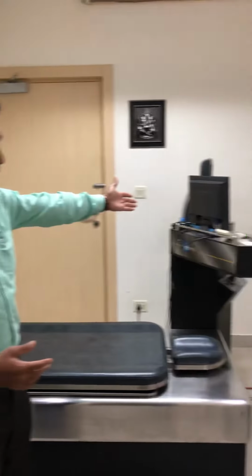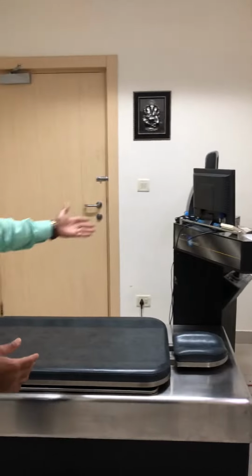Today I am going to tell you about our laser machine. This is the laser machine. The laser machine is used for correction of glass power. It is used to remove glass power up to -15 and +5 as well as for near and distance corrections.